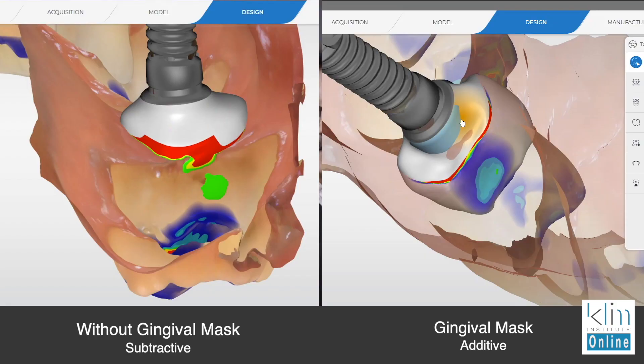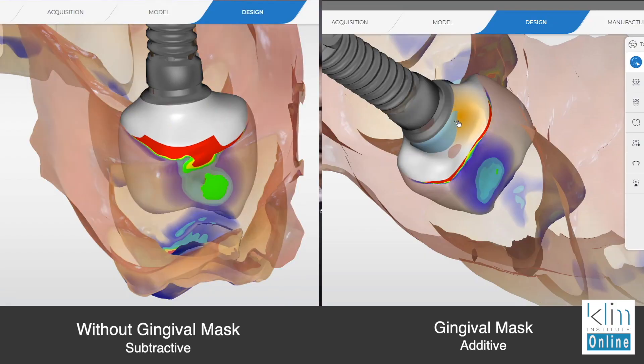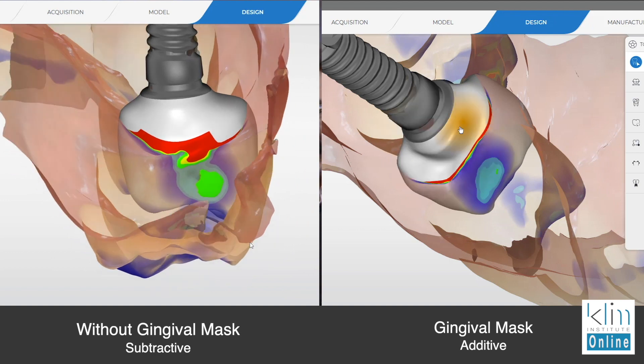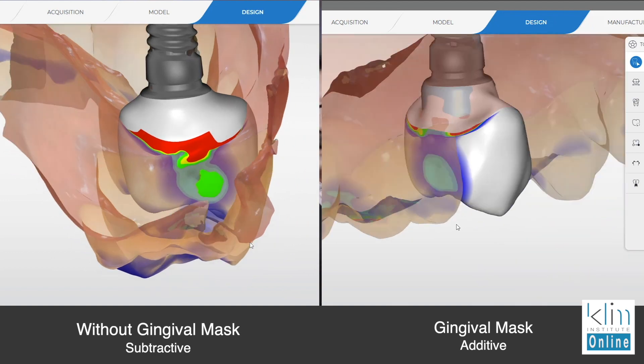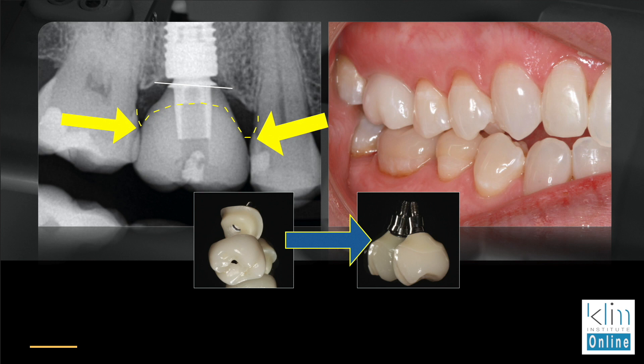I'll actually show you side by side. One is additive, one is subtractive in that sub-gingival emergence. There are certain principles that we use to nail that sub-gingival emergence, so when we screw it down, it's going to look great. People don't get food impaction in that sub-gingival emergence and proximal contours.